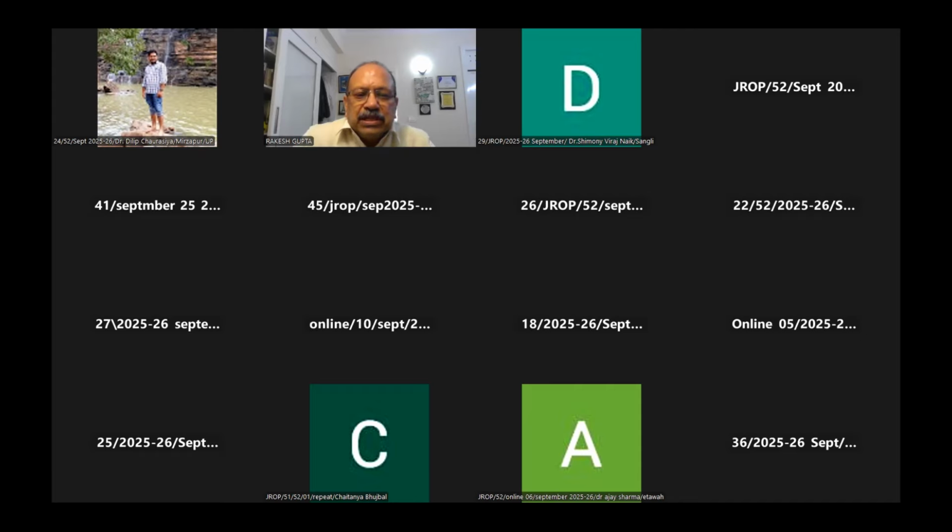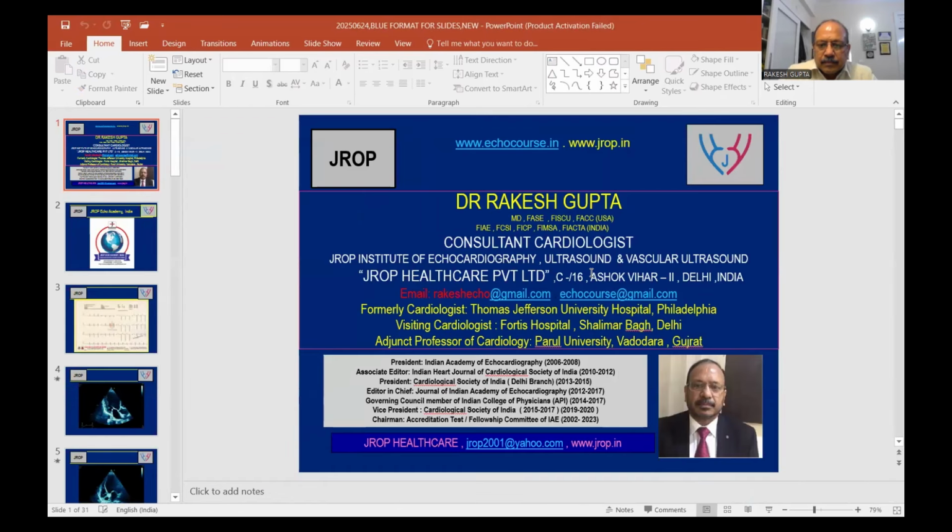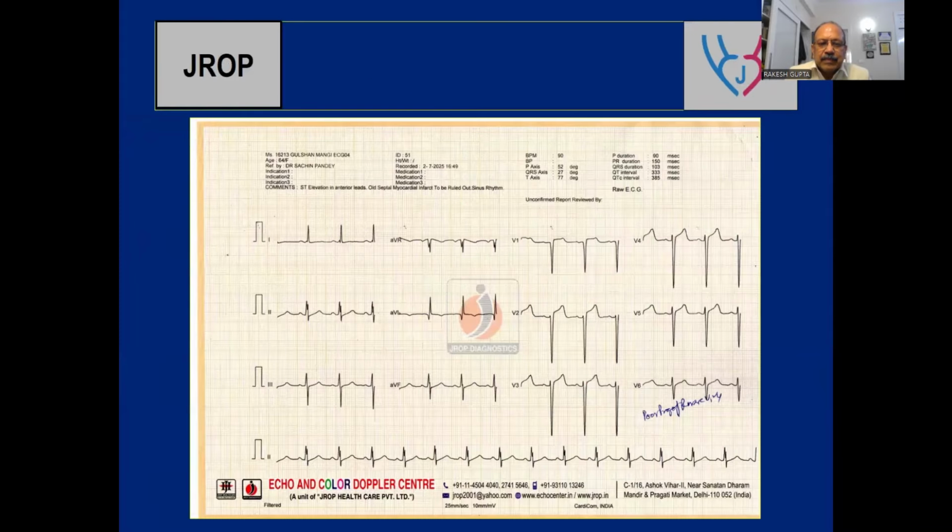And next class is just based on this. I hope you can see my slides. Look at this ECG.